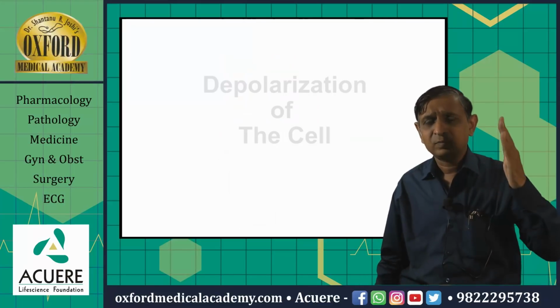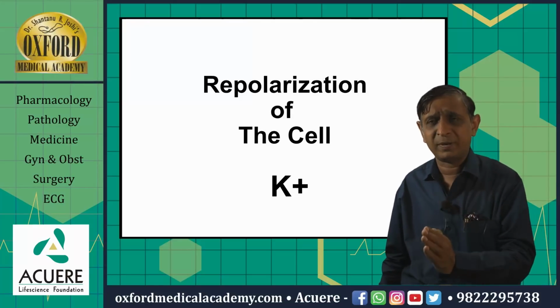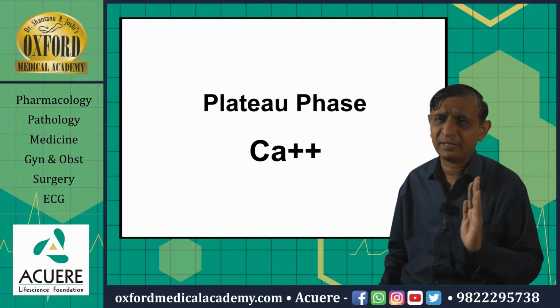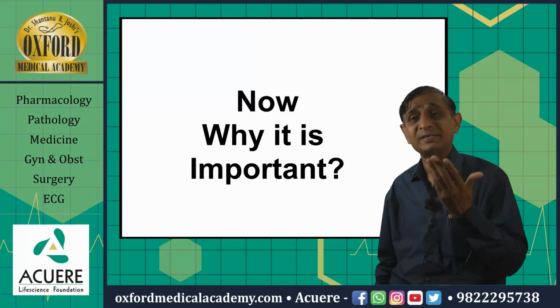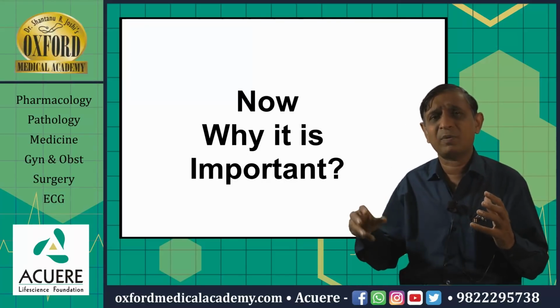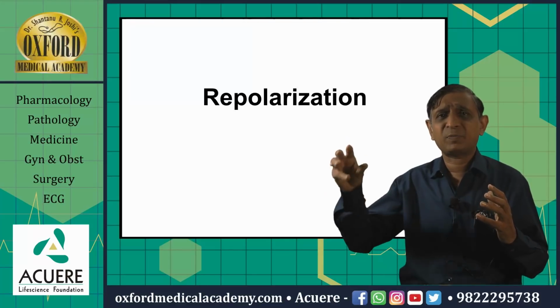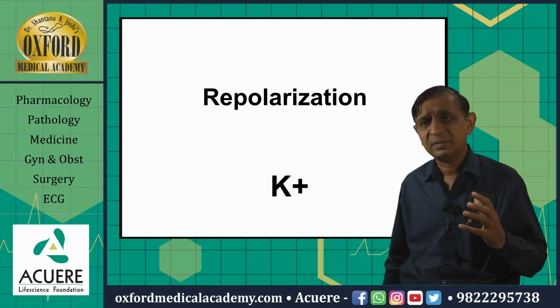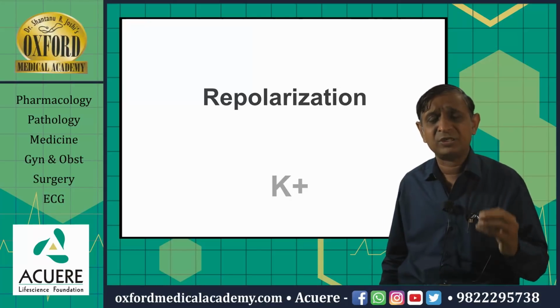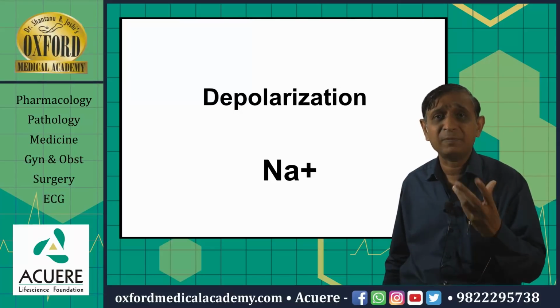Lastly, depolarization is sodium dependent, repolarization is potassium dependent, plateau phase is calcium dependent. Now, why is it important? It is important because if there is any problem in the ECG related with the repolarization, there is a problem with the potassium ions. If there is a problem in the ECG related with sodium, it will be seen in the depolarization phase.